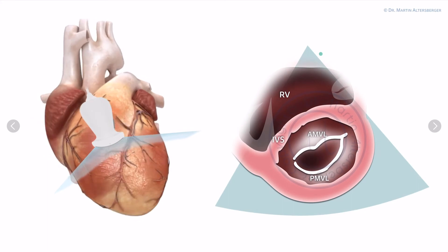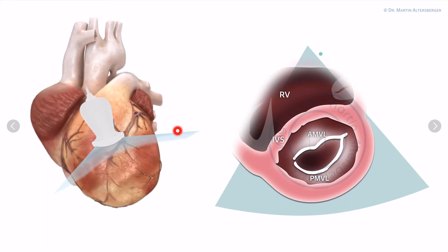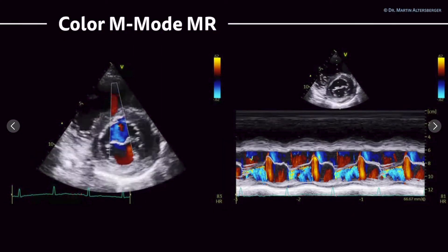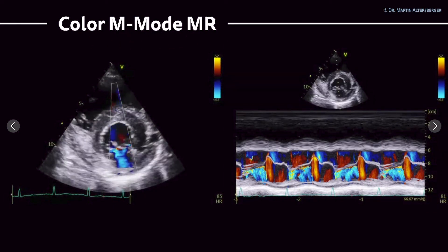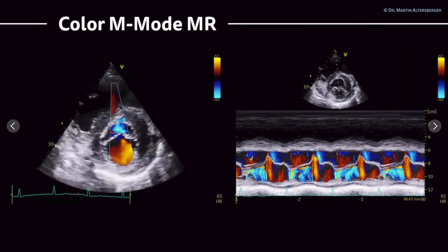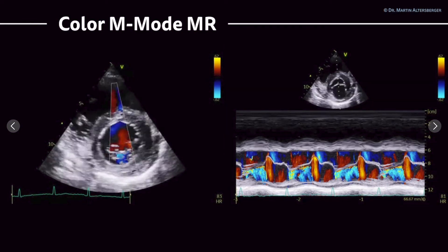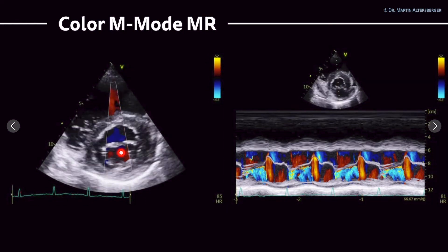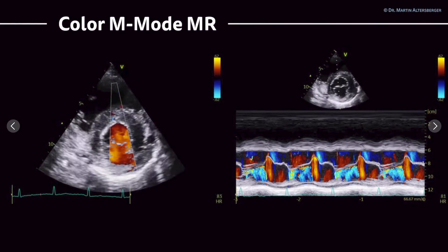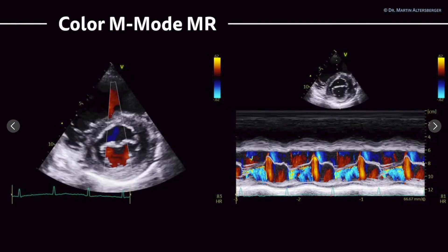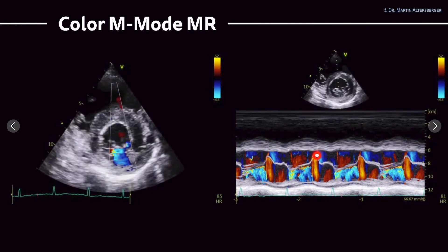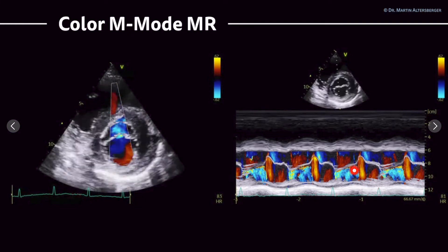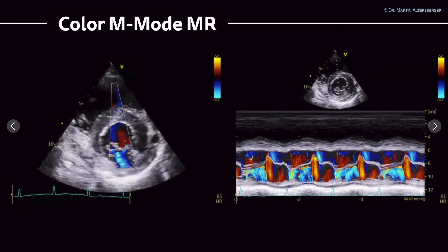Continuing with the mitral valve, we have to remember the next view is the view of the mitral valve — the anterior and the posterior mitral valve leaflet. We see a color M-mode study of mitral regurgitation. This is a case we have already seen before where we said the problem is around the P2 segment — the posterior mitral valve, mid segment — where we have MR. With color M-mode imaging, you can see the opening of the mitral valve and here would be the closed mitral valve, but here we have turbulent flow resembling mitral regurgitation.